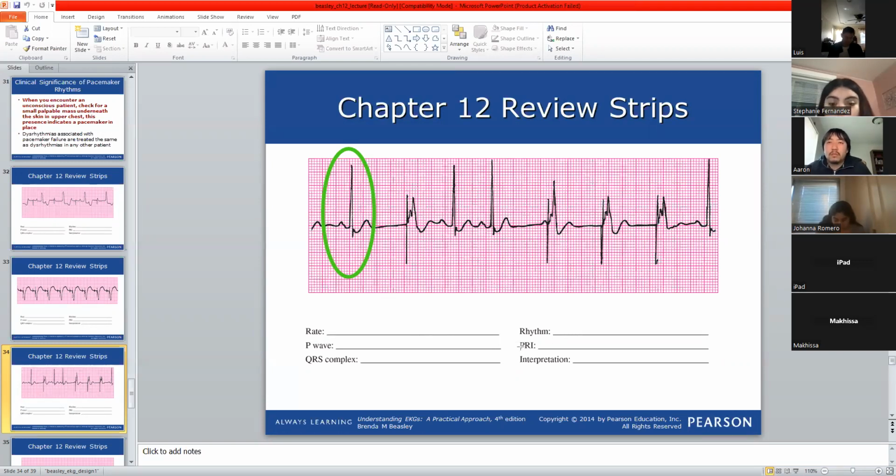Okay, let us talk about this one first. What do you think this one looks like, any other ones here? No, you are wrong. It is the same. The second one is similar: 2P, 1 QRS. Similar to this, right? Yes.